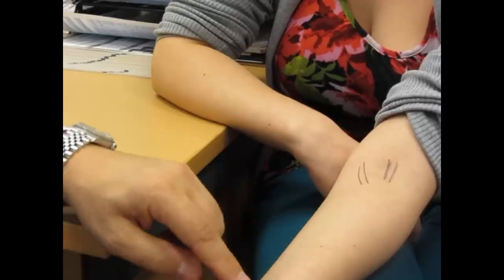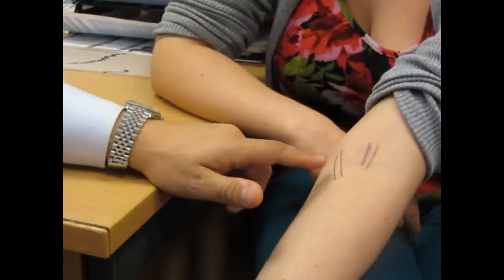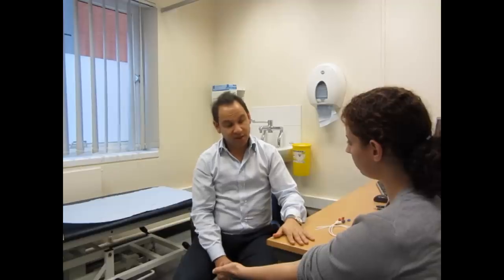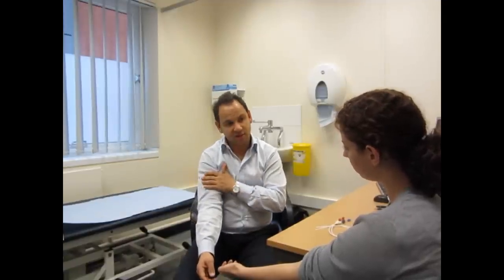Now, as you know, arteries carry blood that is flowing very fast, and it goes from the heart to the tissues, and the veins very passively take blood back to the heart. Now, if we divert the arterial blood into the venous system, the veins start to strengthen and thicken up and dilate. And the good thing about that is, as you know, the veins lie superficially in the arm. And that means that the vein becomes thick and dilated just underneath the skin surface. And this makes the vein accessible for putting needles in. And these needles go in, and one needle takes blood away from the body into the dialysis machine, and the other needle brings it back.